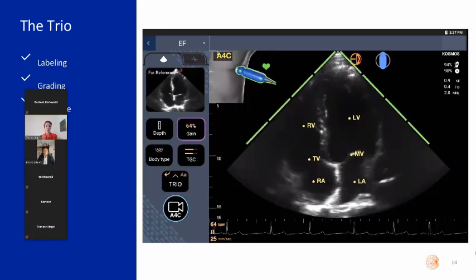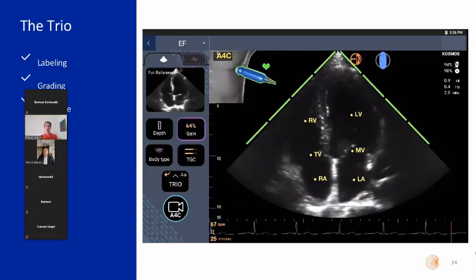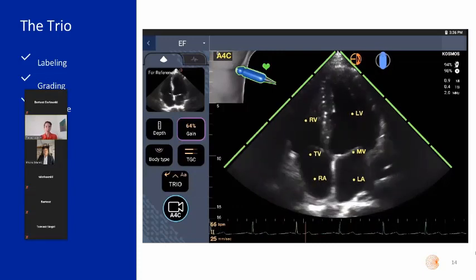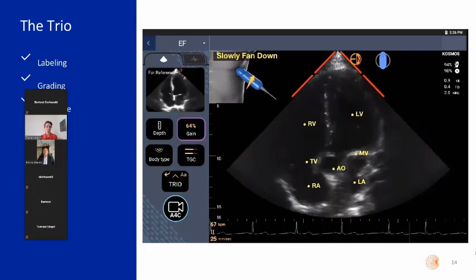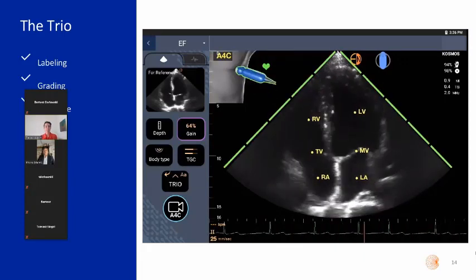And the great thing is when you save the pictures, none of this is on the screen. So the information behind is saved, but you don't have to worry about trying to remove any of the labels, for example. Now, all of this helps to get the best picture.